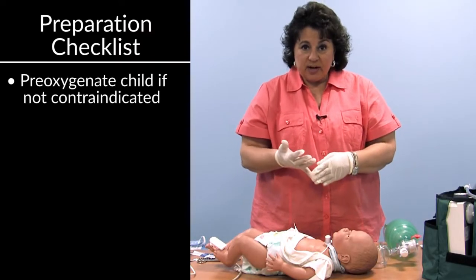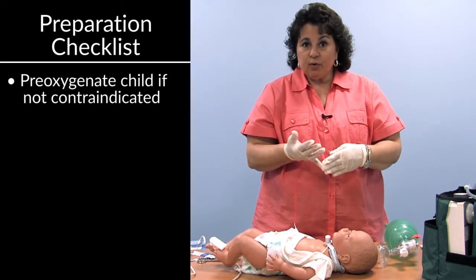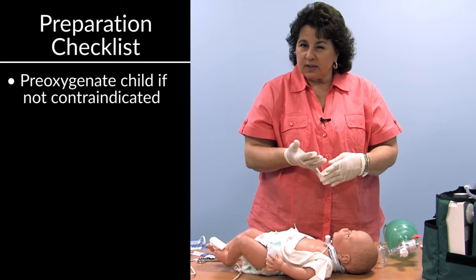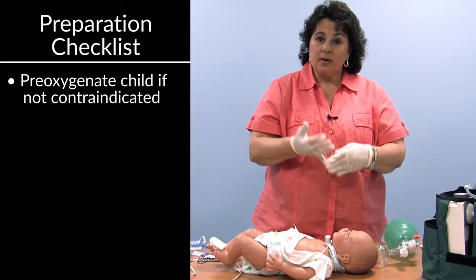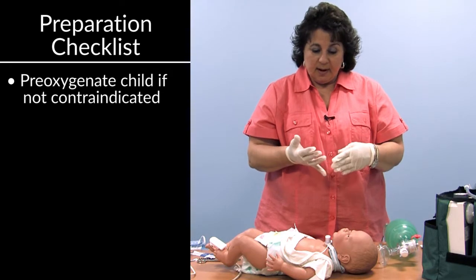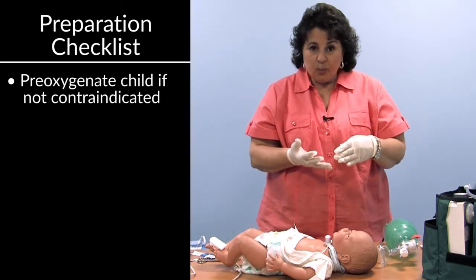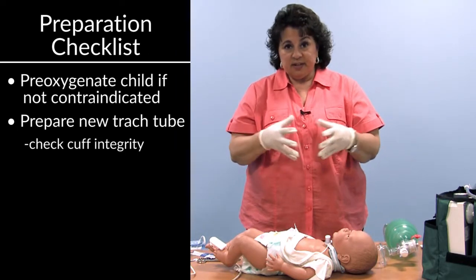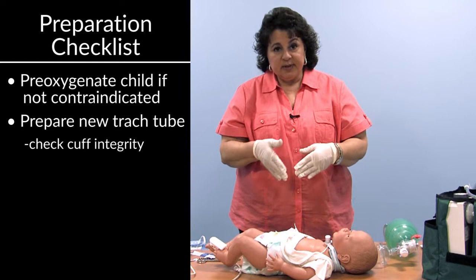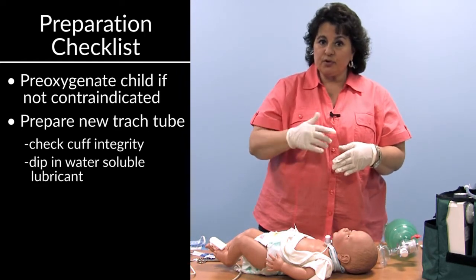So we have pre-oxygenated the patient or the child to have full saturation of the blood in the body and give us a little time before desaturation occurs should we have trouble getting the new tube in. And that would be by your doctor's prescription order. We have prepared the new tube. It has been checked for its cuff integrity, and it has been dipped in a little bit of water-soluble lubricant to make it easier for insertion.